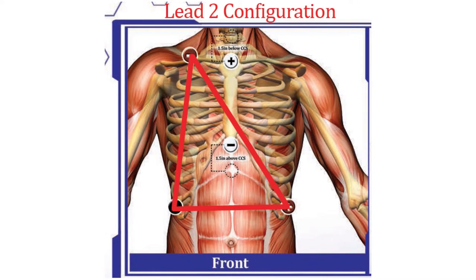We are going to use three leads to form a triangle called the lead 2 configuration. We use this configuration to ensure a highly pronounced R peak, which is crucial for data analysis.